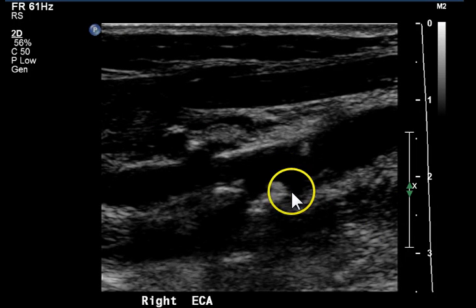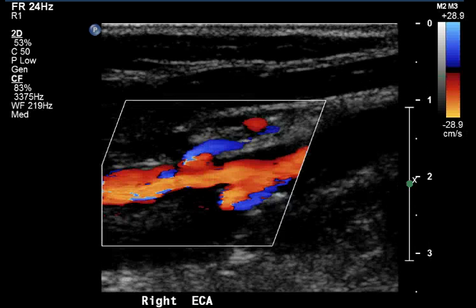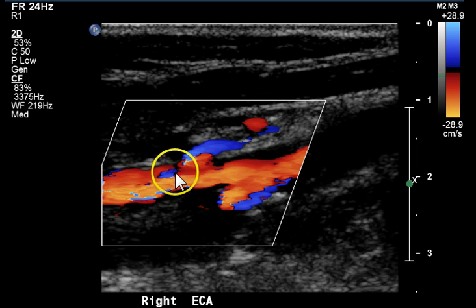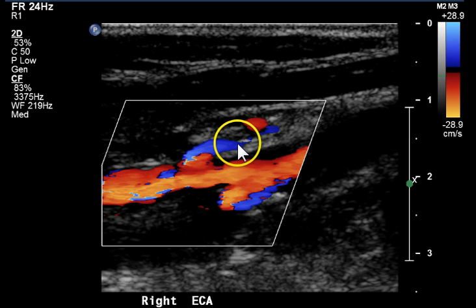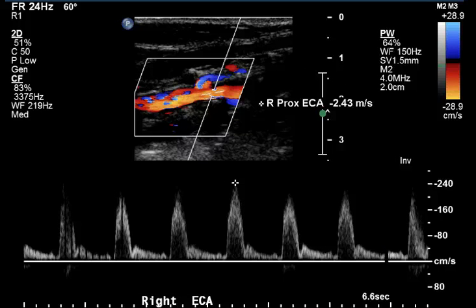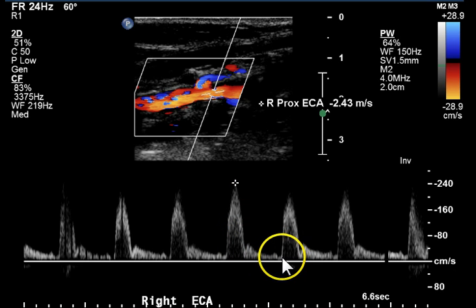Grayscale showing again some calcific plaque in the distal common carotid artery and a little bit in the origin of the external carotid artery. Color Doppler demonstrates a widely patent external carotid artery with a branch coming off in an anterior direction — most likely the superior thyroid artery, flowing in the opposite direction as the ECA. The Doppler waveform again shows some rounding, indicating some disease upstream, with a dichrotic notch and relatively low diastolic flow velocity.